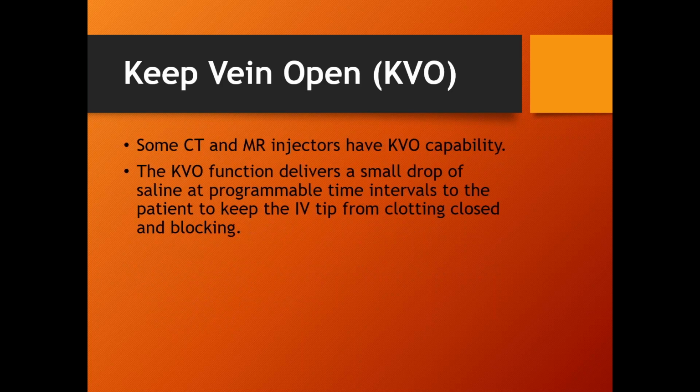KVO, that's a feature. Not a whole lot of injectors have it, but if you're an infusion pump person, you're familiar with KVO. Keep vein open. What that does is every so many seconds, the injector will just push a little drop of fluid out the IV needle just to keep the tip of the IV needle from developing a blood clot or the vein from clotting.